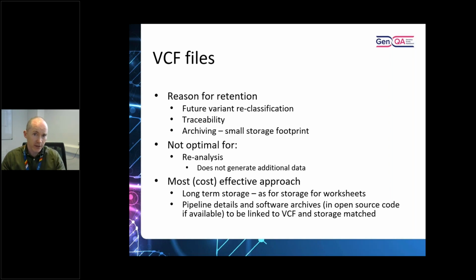And the equivalent of VCF should also be considered, as that's what we use for, let's say, fusion calls or something.